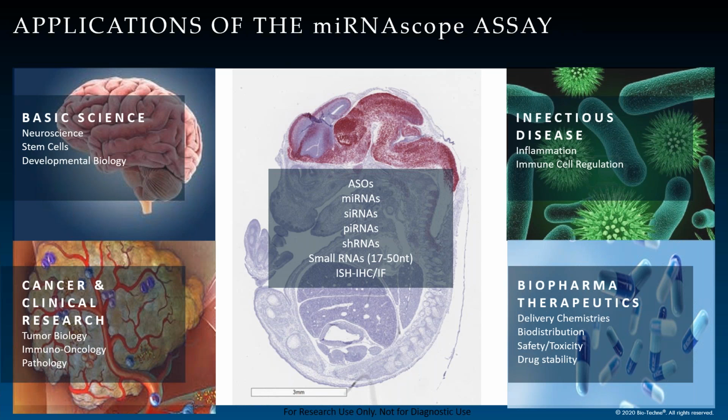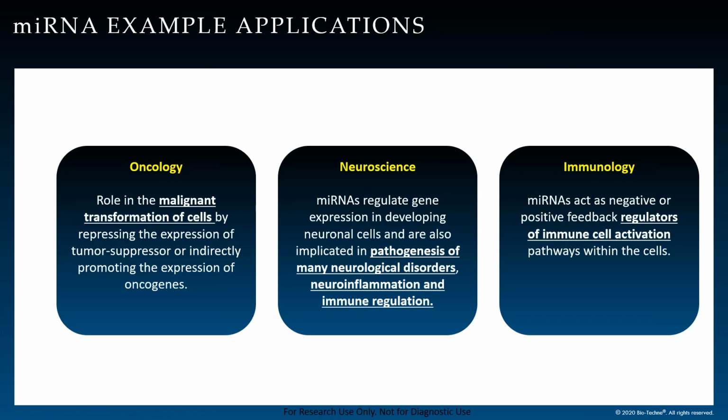Finally, cancer and clinical research. As I mentioned, all of these small RNAs have the potential to be deregulated or impact a particular condition, such as they can be used in tumor biology, immuno-oncology, as well as pathology. So let's move on to the miRNAs applications.